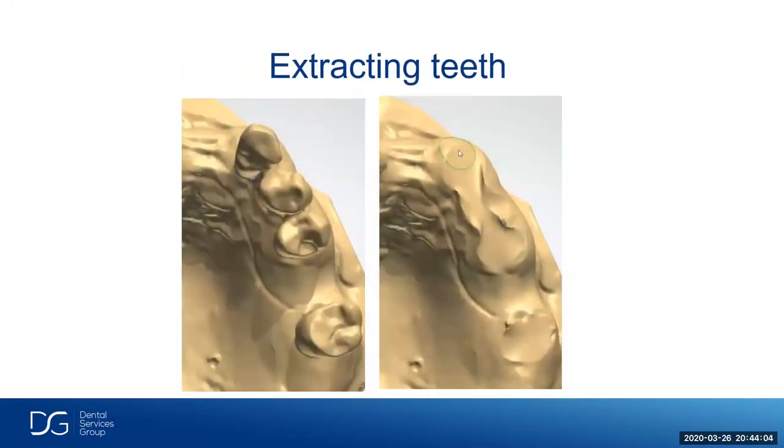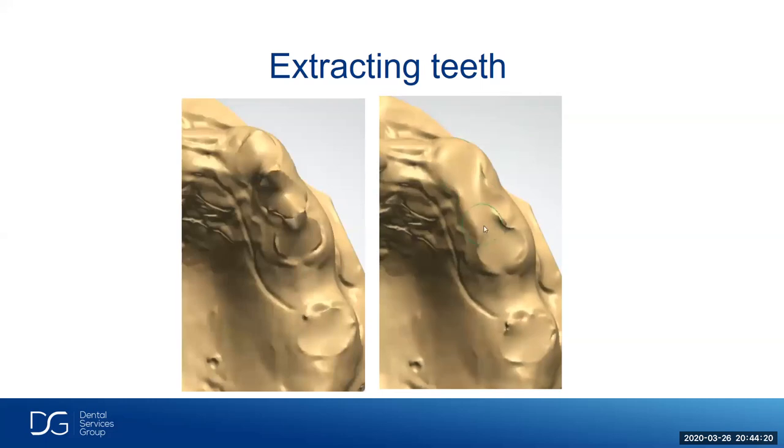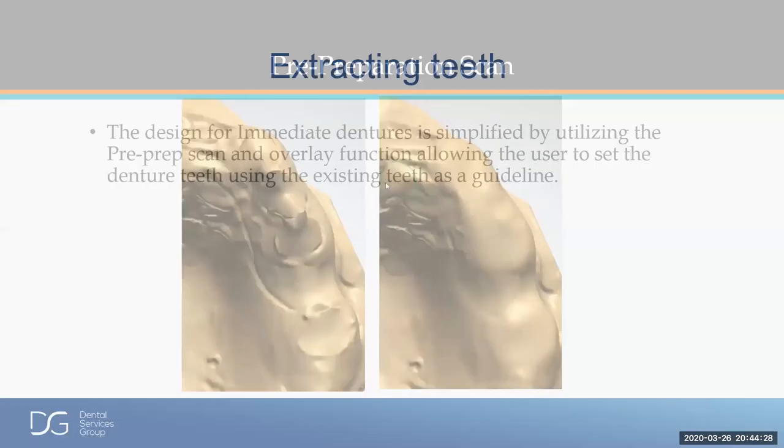And extracting teeth, this is probably one of my favorite parts of the whole program, with immediate dentures. All we have to do is highlight the tooth, click on it, and the tooth disappears. So instead of doing model surgery in a laboratory by grinding the stone, we do this virtually. And we'll contour the tissue, remove some bone, and just get everything to where we want it before we start setting the denture teeth. A lot of great tools.